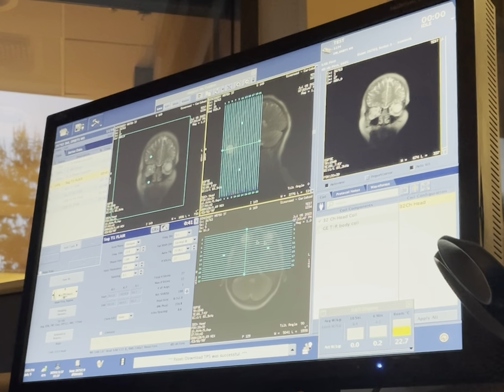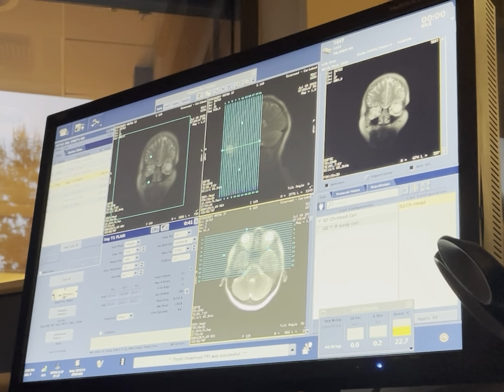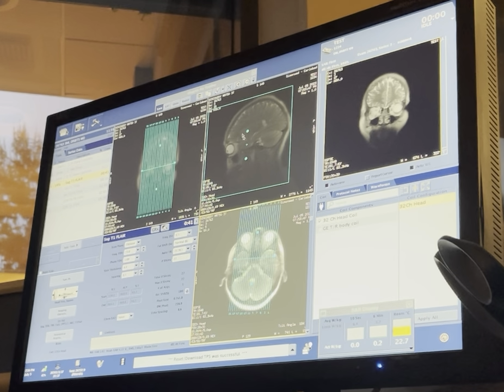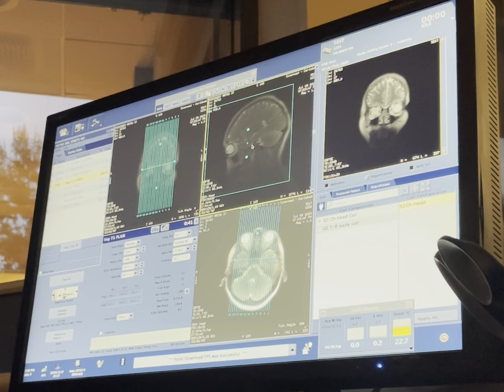What we're gonna do is go in our axial plane. And we're gonna do all slices for sagittal plane. Normally they go left to right, but in an axial, if they're supine, it's swapped. So this is actually her left side and this is her right side, as indicated by this R. So we're gonna put our slices that way, and you see how our box formed in our sagittal now? Okay. So, yeah, like right there is good.